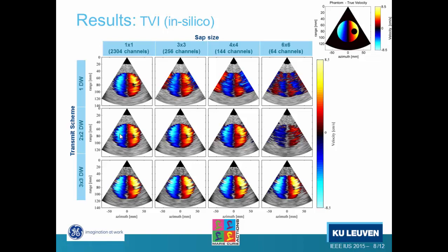So our energy will be coming mostly from this direction, which has a positive velocity. So we have a strong bias on our velocities, and we also see, especially in these cases, some underestimation. As we can see, we don't get these higher velocities up here.